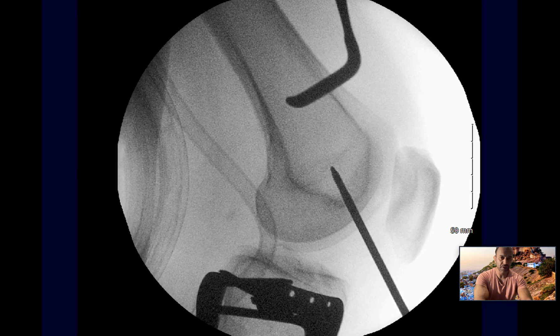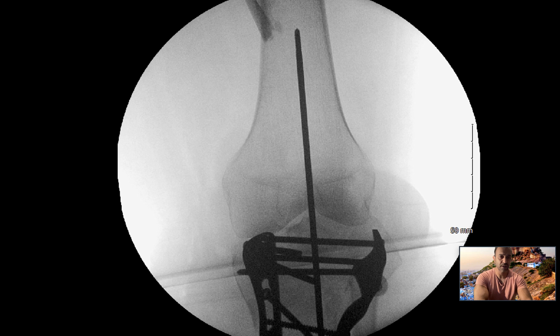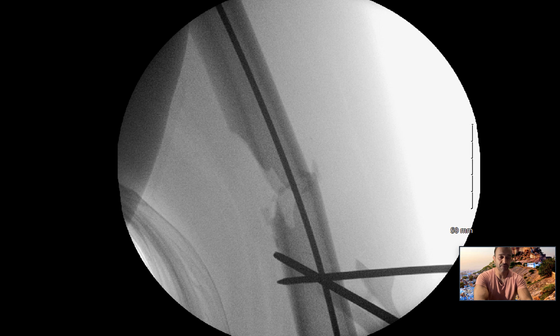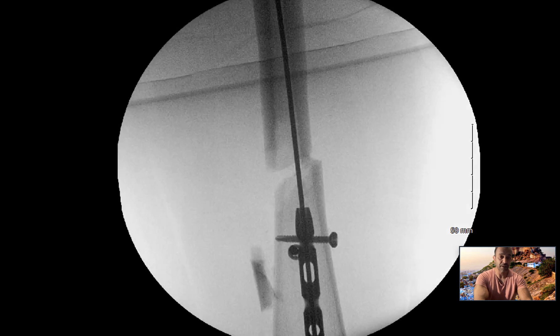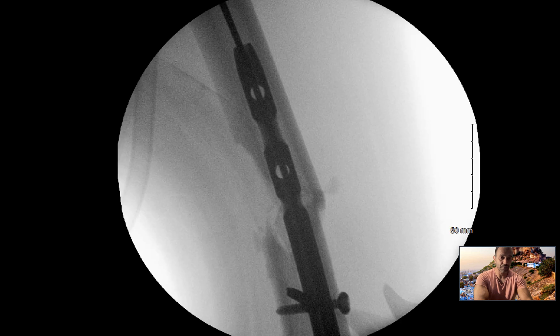I use blocking screws on occasions, and I use blocking screws when I'm trying to address the working length of my construct, and to accommodate for bone deficits. Therefore, here we've got a posterior and a medial bone deficit, which would lead to a varus and apex posterior deformity. I'm using these blocking wires as a template guide, and I've then replaced them with screws, and as the nail passes, it corrects the deformity, and I've got an even working length between the isthmus and the blocking screws, as you can see here.